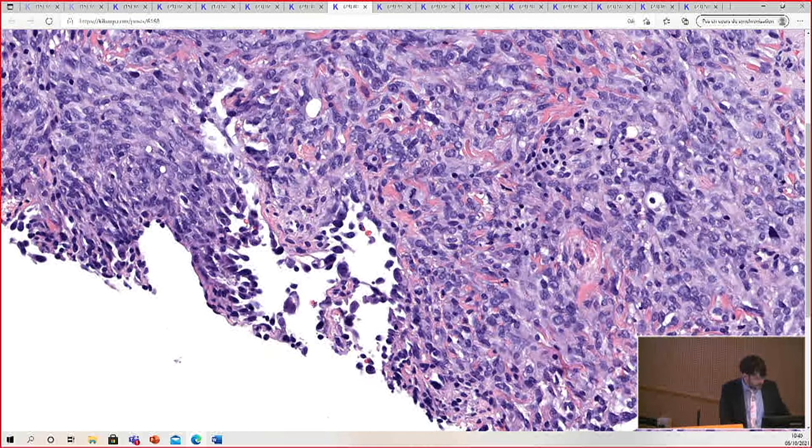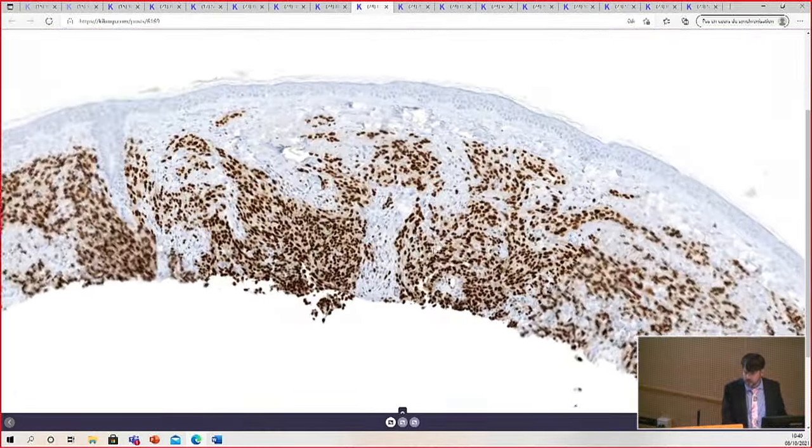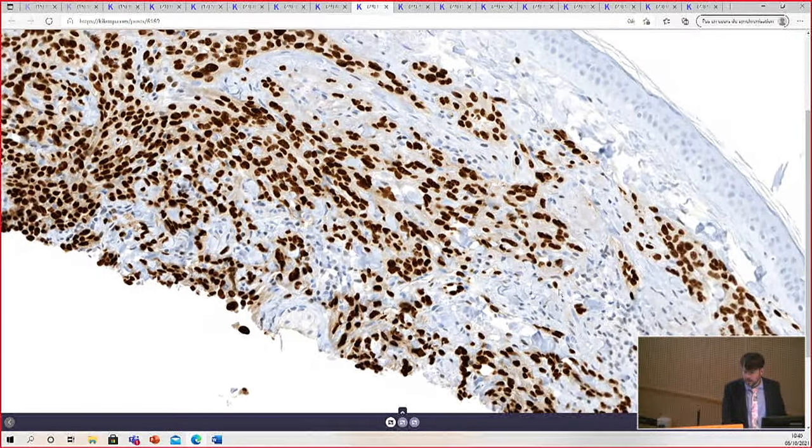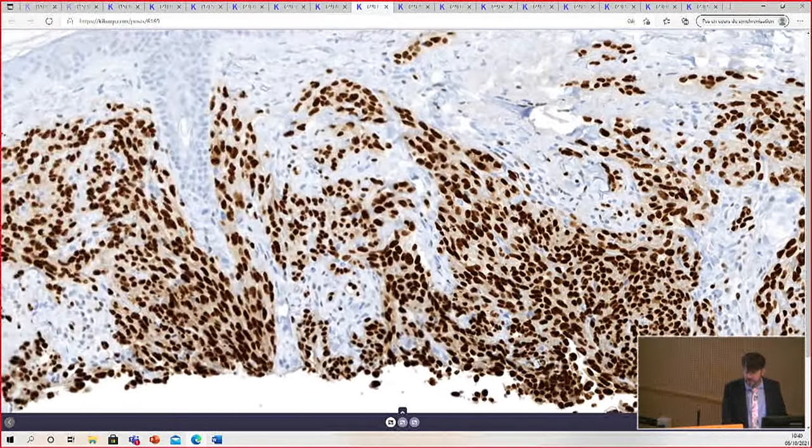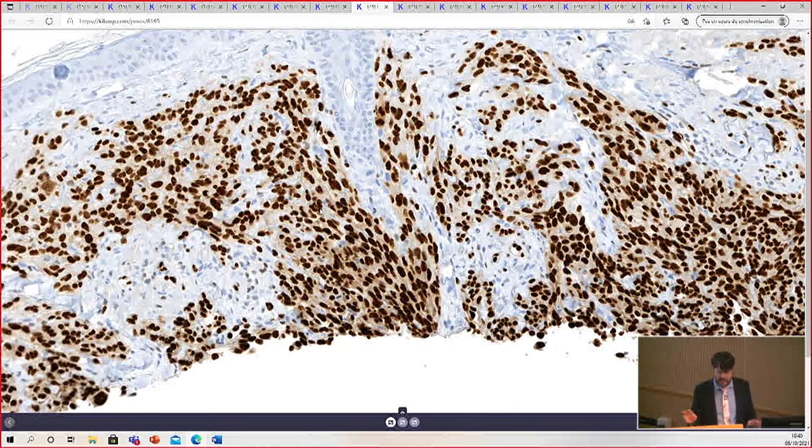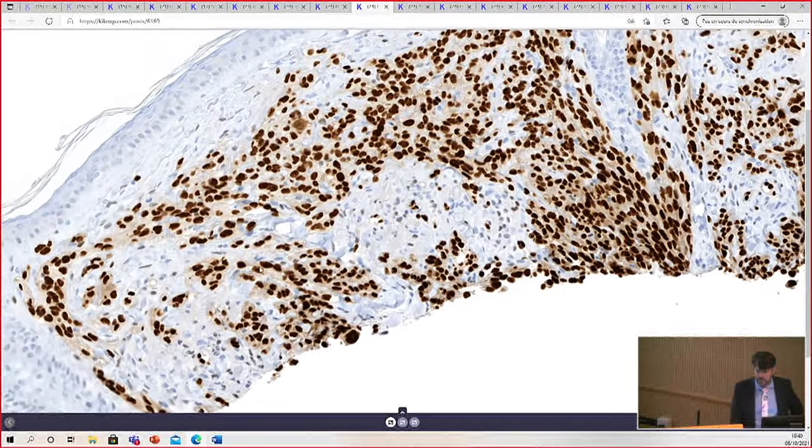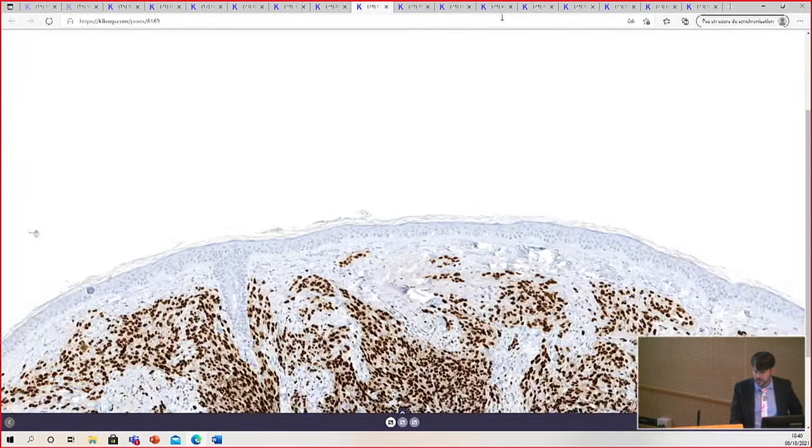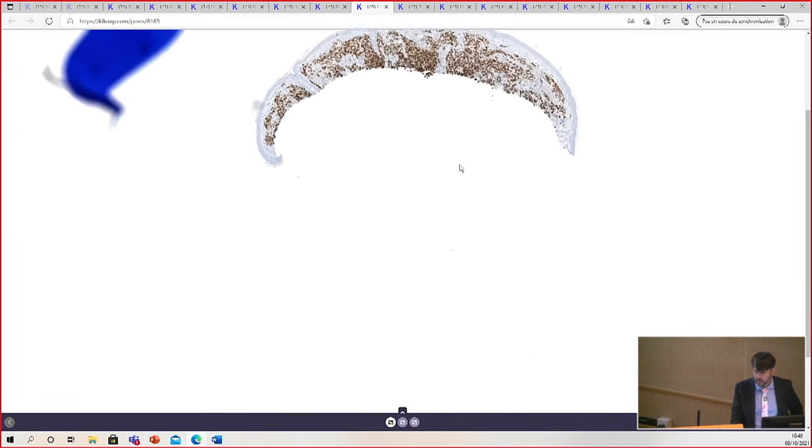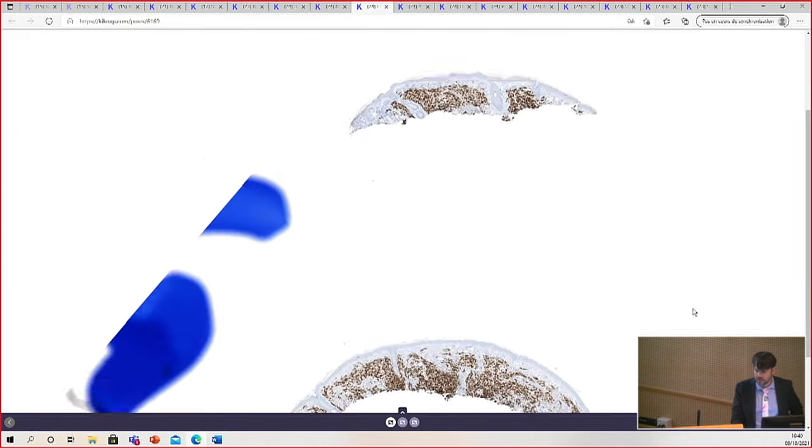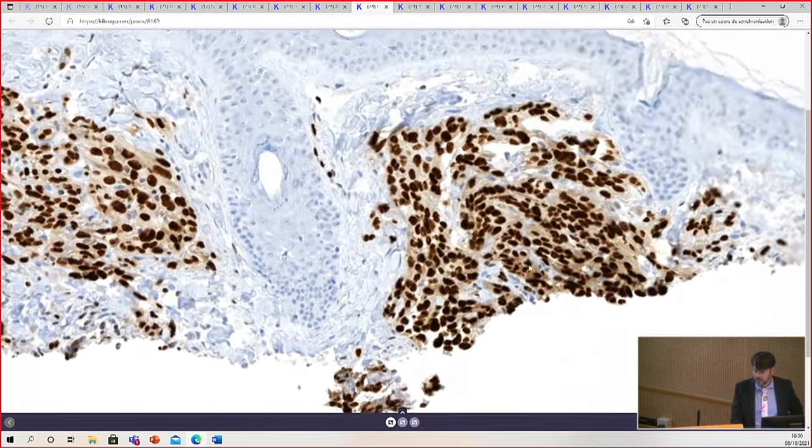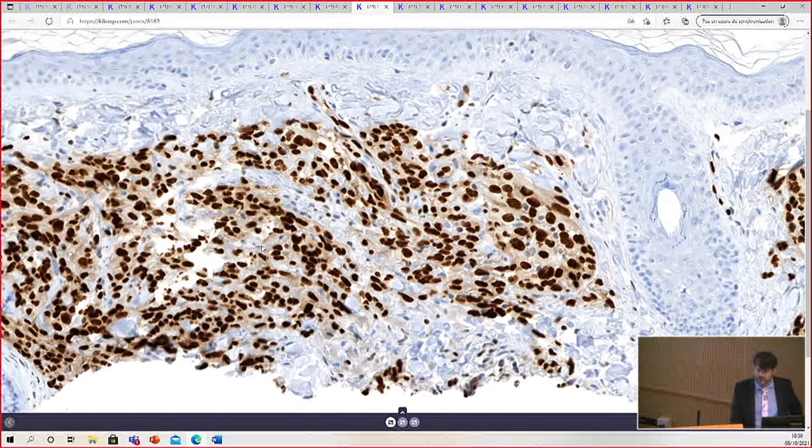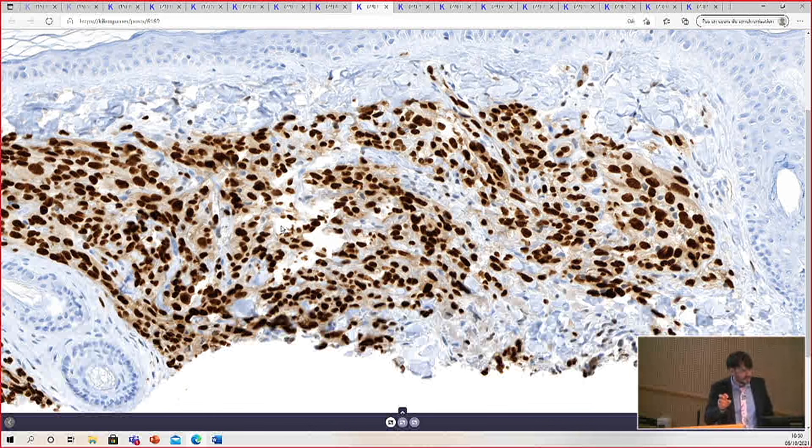So I'll show you the immunostains. This is ERG, E-R-G, diffusely positive. And you can see it's not really quite so sheet-like as it looked. It's actually forming little nests and infiltrating in between the dermal collagen. And then here you can see maybe a little bit of vascular channel formation, but really each of the spaces is filled with cells. So very challenging.